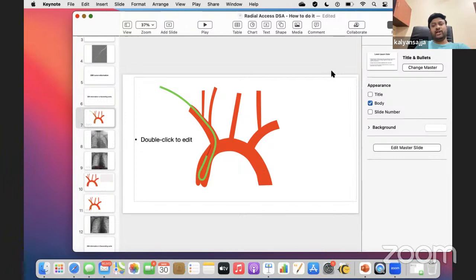Left bovine arches are easy. The non-bovine arches, you should not attempt stroke, I think, in many cases, unless absolutely needed. But for strokes, in my setup, I need to balance the economy. So I use a 081, like the Fubuki 7 French 081 catheter rather than a 088. And a Cat 5 and even a Cat 6 goes through a Fubuki 081. And you don't have to exchange the sheath for a 088 and all that to the radial. You just put a 7 French sheath, go through it with the 081 and go all the way up.